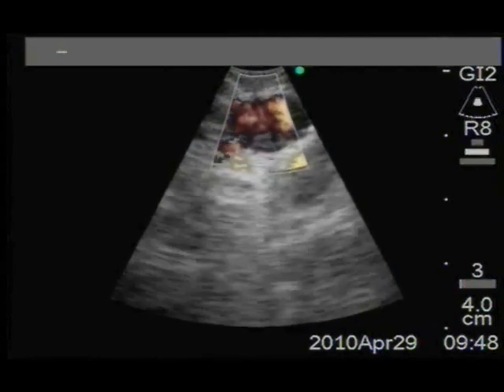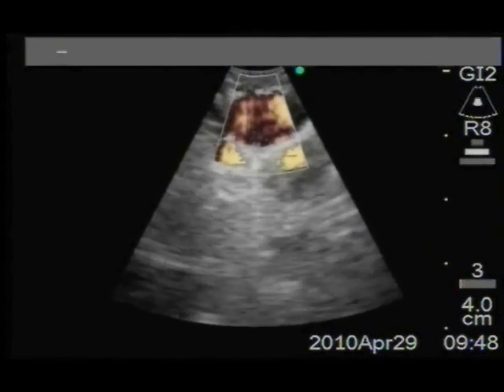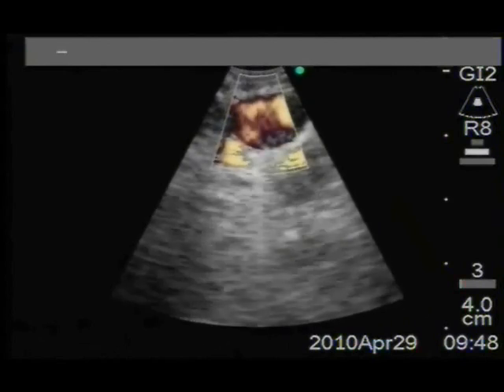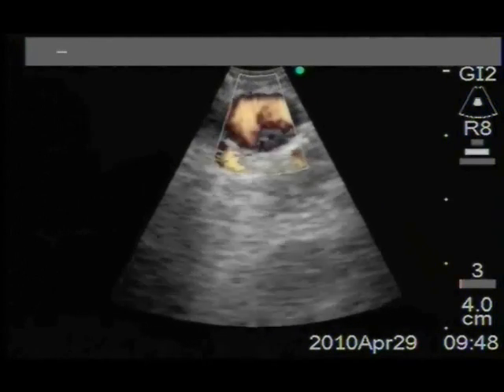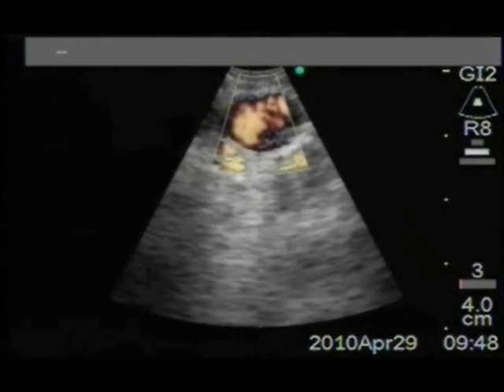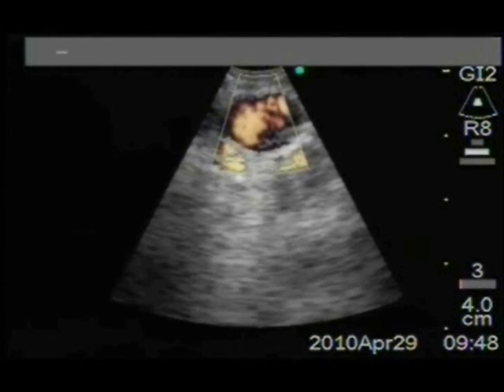Orienting the scope laterally towards the right, just above the main carina, the azygous vein is confirmed as a vascular structure using Doppler mode.